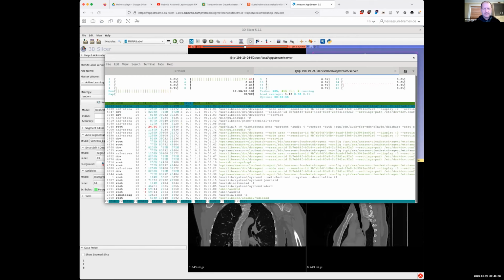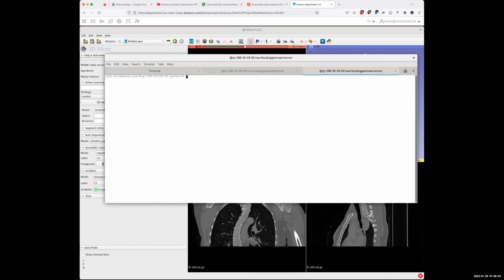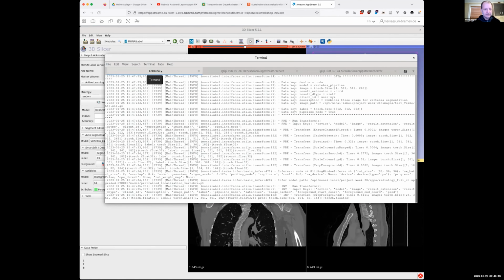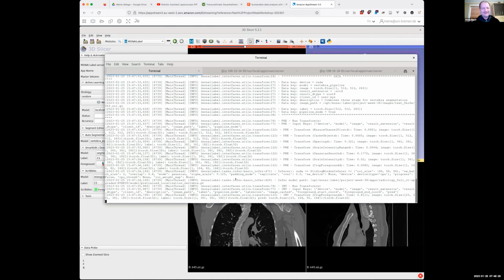Oh, okay. So this is actually a Linux machine. This is a Linux machine, so we got 16 virtual CPUs. Yeah, you can do that to monitor the graphics card usage as well. Yes, cool. Nice. Yeah, it's funny. We always used Windows machines for our app streaming before, and I didn't even notice the difference.